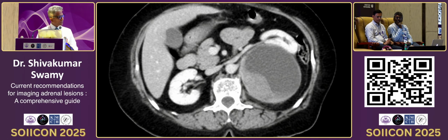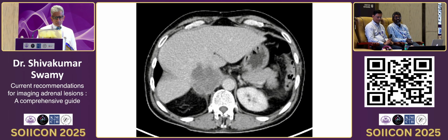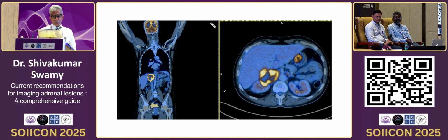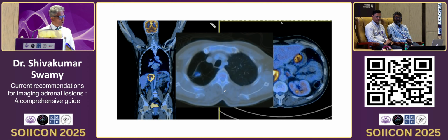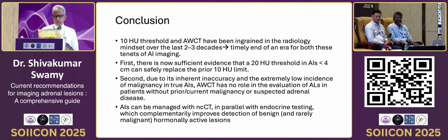So this turned out to be a schwannoma, a primary schwannoma of the adrenal gland, and this is of course looking very heterogeneous, probably either malignancy. When we did a PET scan, of course there was a small nodule and the biopsy turned out to be metastasis from the lung. This is the leiomyosarcoma of the adrenal gland, where probably the tumor has arisen from one of the vessels.